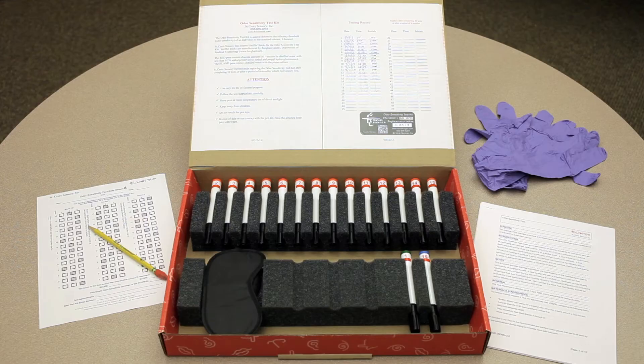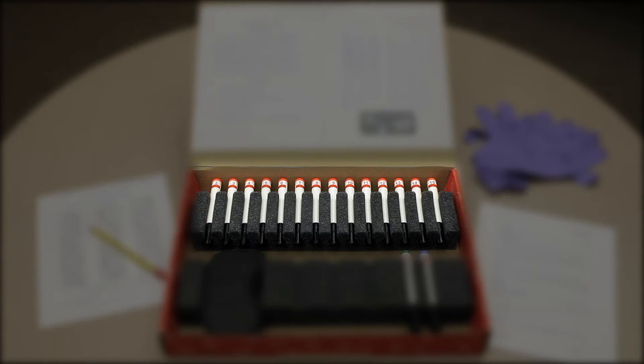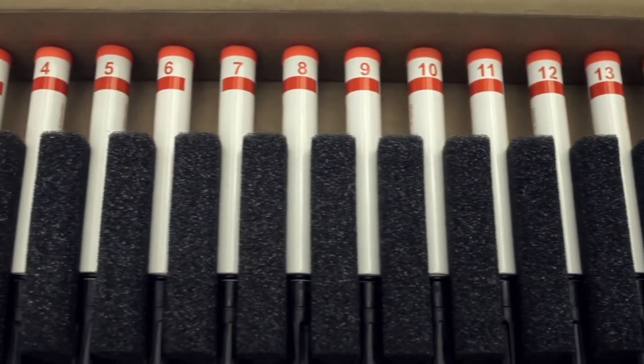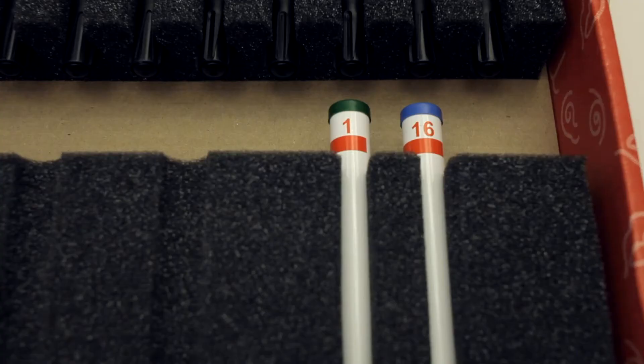This kit's been adapted from testing in medical clinics. The odor sensitivity test kit contains a series of odorant pens containing the odorant n-butanol with increasing concentrations from pen number 15 to pen number 2, two blank pens numbered 1 and 16, a blindfold for the individual being tested, and gloves for the test administrator.